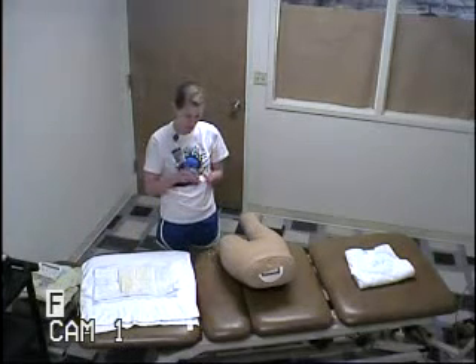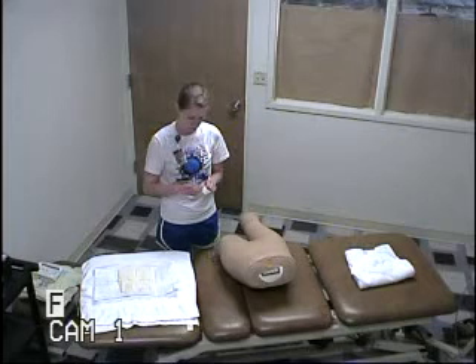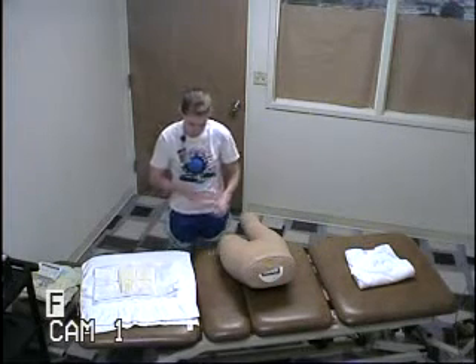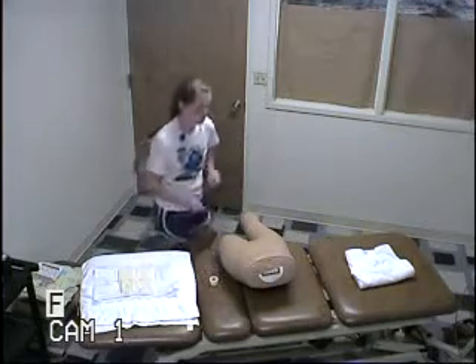And then I'm going to go ahead and get my tape. Keep it right there, ready to go.